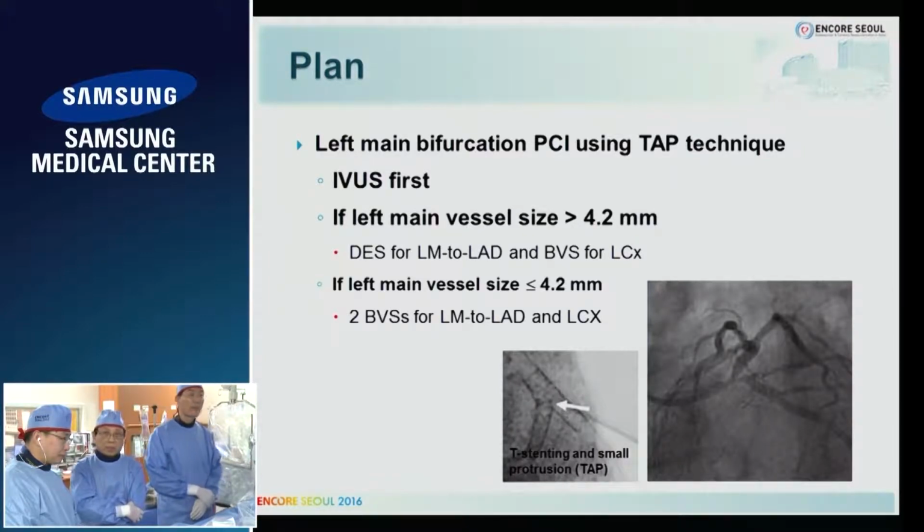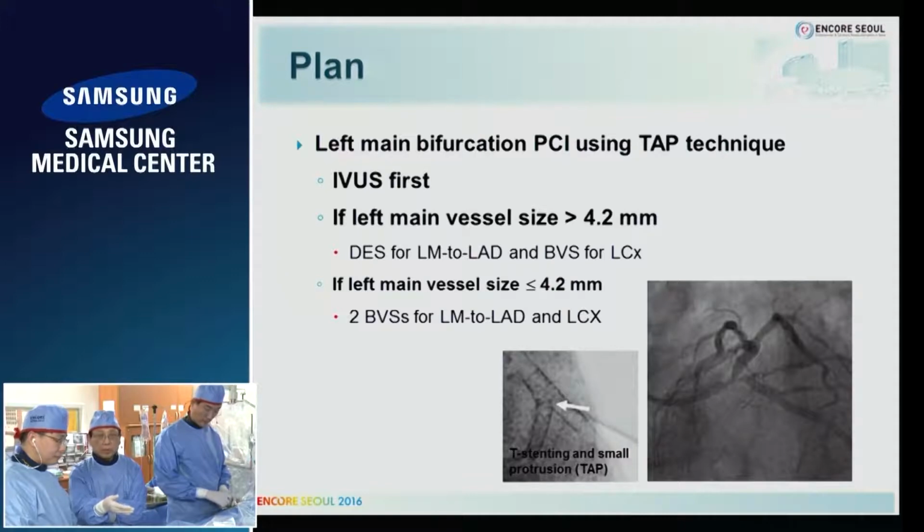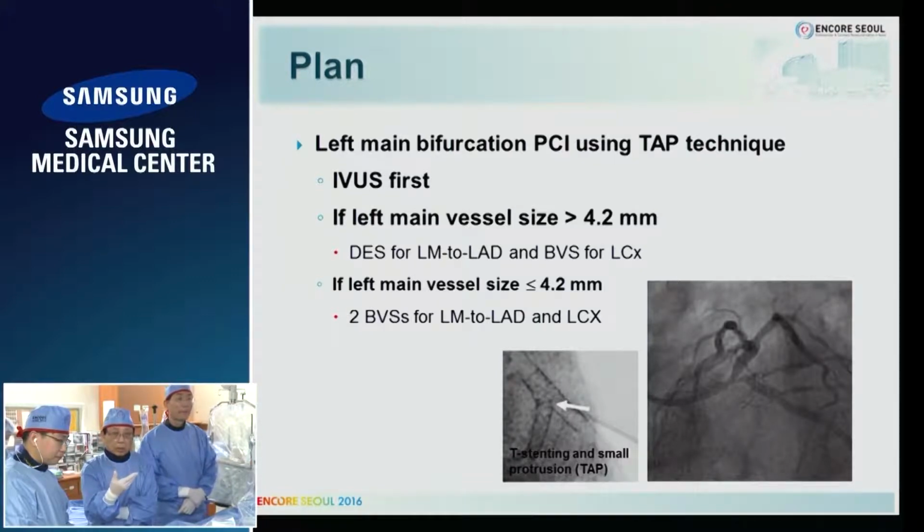with the OCT. You may also argue why not IVUS, because we have used IVUS. We love to use OCT because with OCT we can get very detailed information. For example, even wire position, we can get some idea about this from OCT. But also, if we have malposition or disruption or fracture, or even mini fracture or mini thrombus, we can detect from OCT. So OCT is very helpful to assess the result of our case.